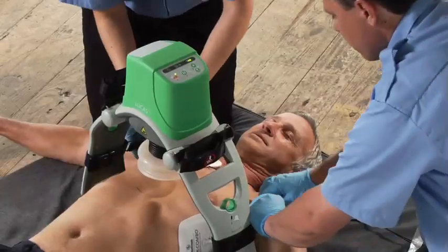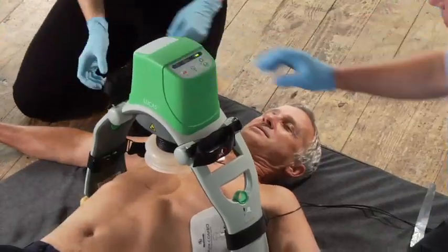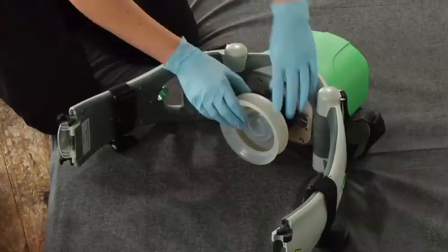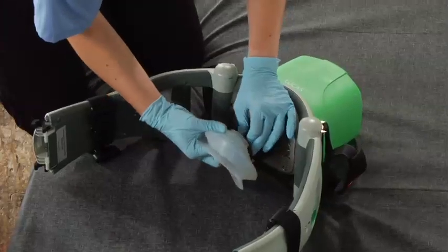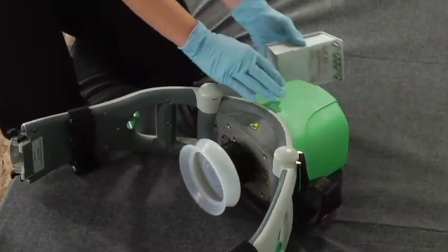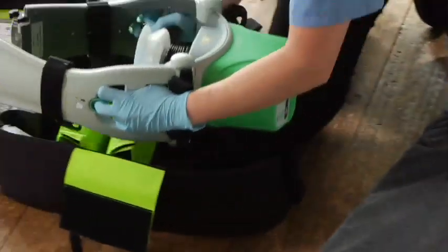To remove Lucas, detach the stabilization strap. Push the on-off button for a full second to turn it off. Disconnect the upper part from the back plate with the release rings. Remove the back plate if the patient's condition allows. Clean Lucas as necessary before putting it back in the bag — do not immerse it in liquid as liquid entering the hood can cause damage. To change the suction cup, peel it off and dispose of it as contaminated medical waste, then put the new one on and make sure it's fully seated. Replace the battery with a fully charged one and put Lucas back in the bag along with the stabilization strap.